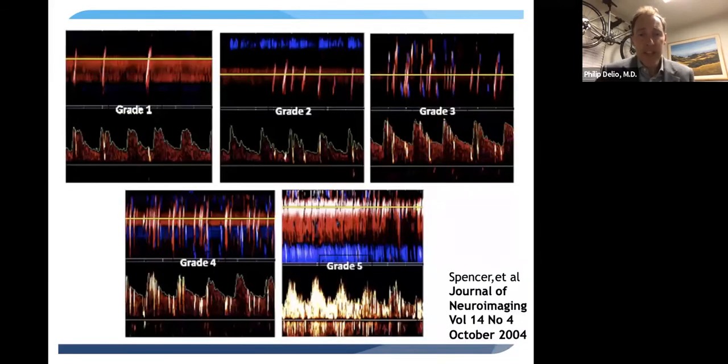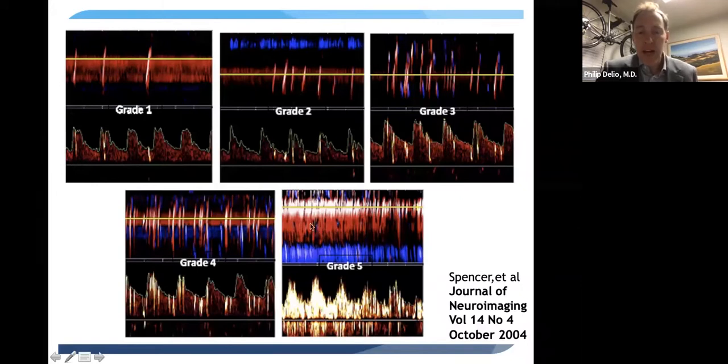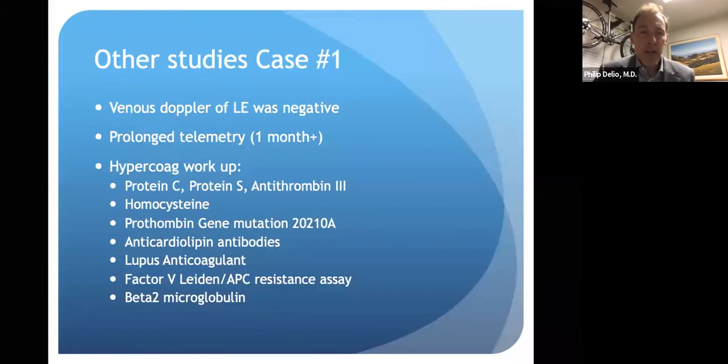This is an example of TCD. If you haven't seen transcranial Doppler, what you're seeing in these imaging studies are the different grades of quantifying the degree of shunting seen. Grade 1 are a few of what are called microembolic signals, which are those brief, shooting little spikes, as you can see here, throughout the tracing. And as you go to different grades, by grade 5, you have tons and tons of these microembolic signals getting across with a bubble study or another test. This is how we categorize and grade PFOs using transcranial Doppler.